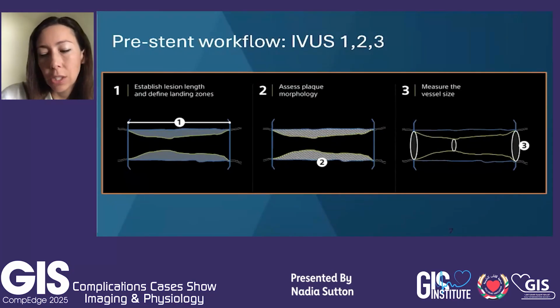So launching into the IVUS, sort of where we use AI versus where we would be using our human interpretation. One piece of good news is that we are still needed as humans to interpret the clinical scenario for the patient in terms of where we should be selecting our stent location for implantation and the length of the stent, as well as some other guidance.